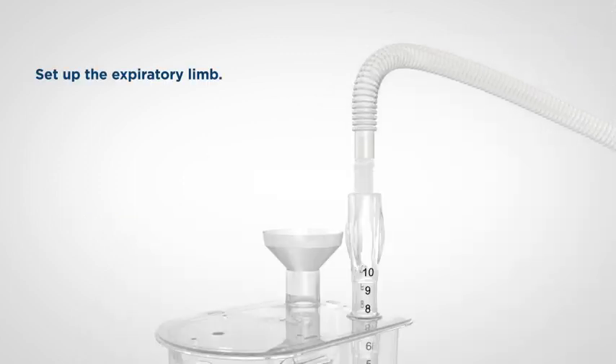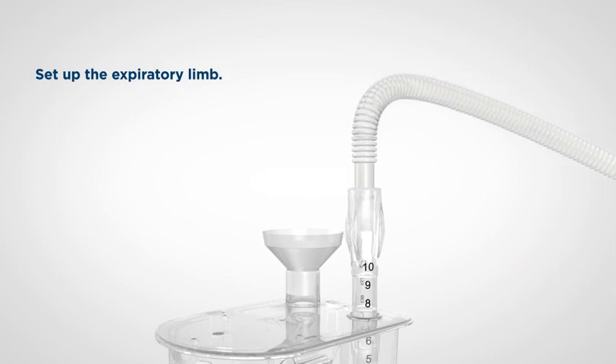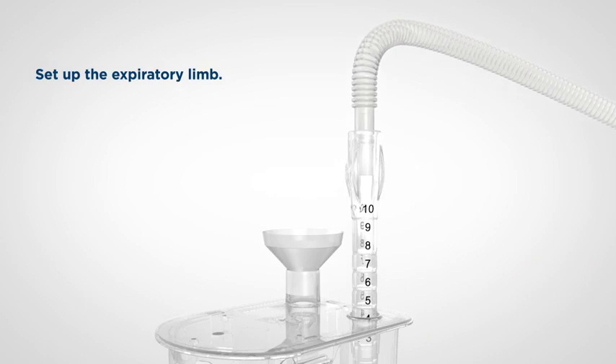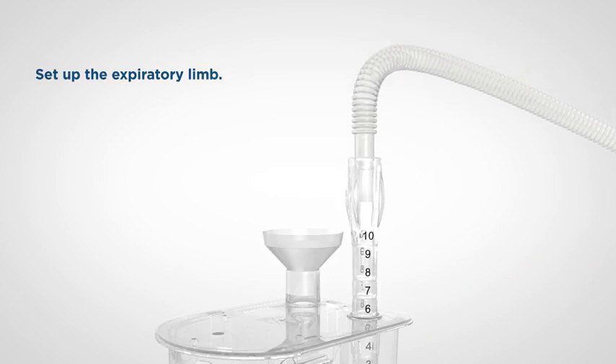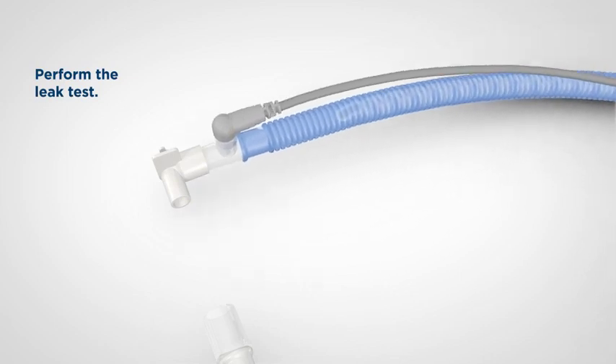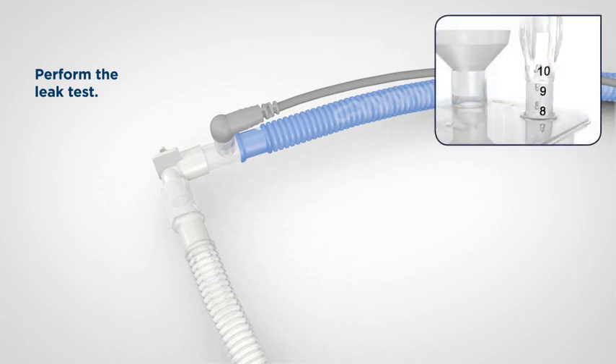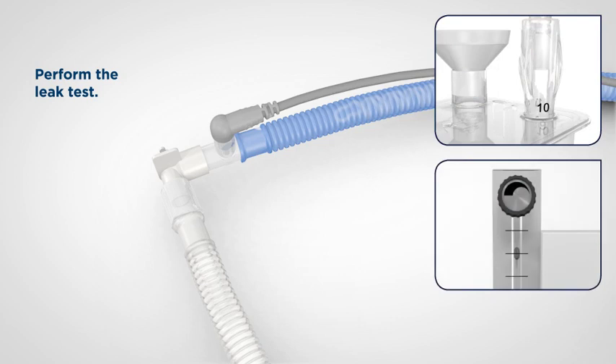Connect the clear expiratory tubing to the top of the CPAP probe and set the desired CPAP pressure by pulling out or pushing in the probe. Connect the test flow elbow — white connector — to the inspiratory and expiratory limbs to obtain a closed system for checking air leaks. Once the elbow is in place, set the CPAP probe to 10 centimetres of water and the input flow rate to 1 litre per minute.